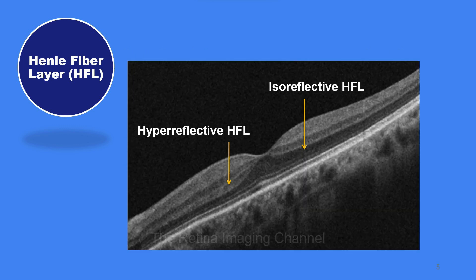Let us look at this OCT line scan, specifically the ONL on both sides of the fovea. We can see that on the temporal side the ONL is completely dark without any distinction. Whereas on the nasal side of the fovea we see a hyperreflective band on the inner aspect of the ONL. This is the hyperreflective Henle fiber layer, visible on the nasal side but isoreflective on the temporal side.